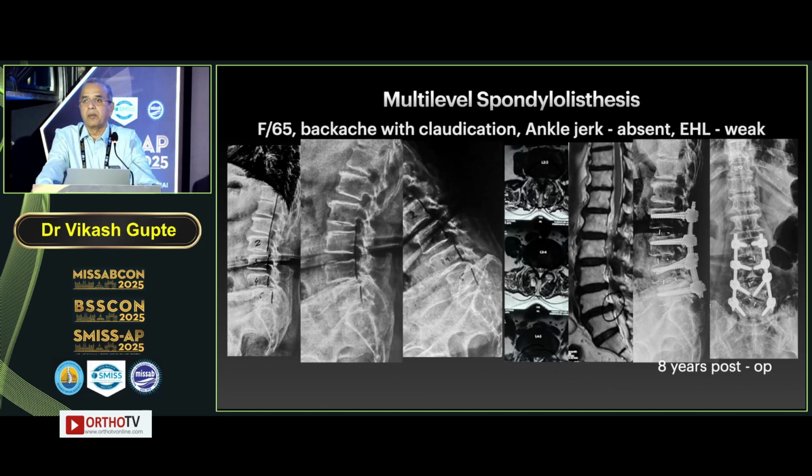What about multi-level spondylolisthesis? This patient with a 3-level spondylolisthesis, we have done a MIS-TLIF, all cages passed, all screws passed percutaneously. This is the 8-year post-op X-ray.